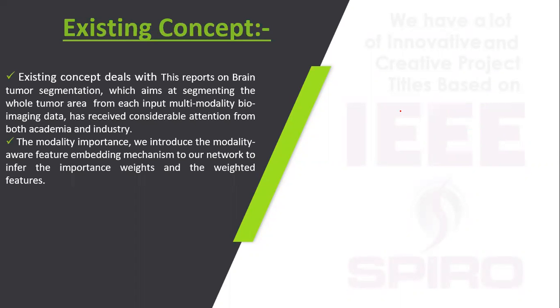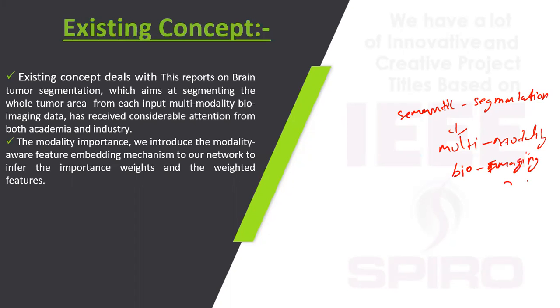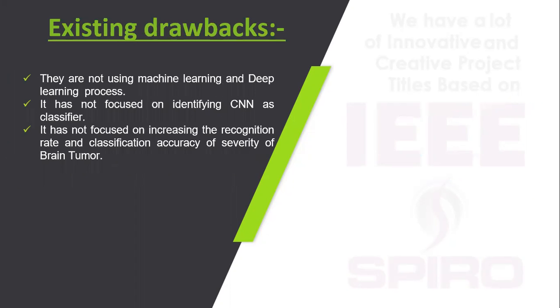Existing concept. They are using semantic segmentation, and as input they use multi-modality bioimaging data. Existing drawback. They are not using machine learning and deep learning methods, they are not focused on the CNN model, and they are not focused on the best accuracy process also.